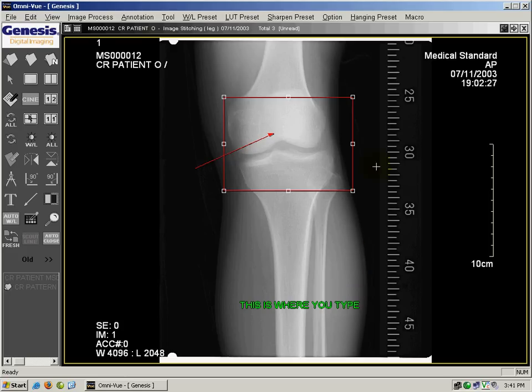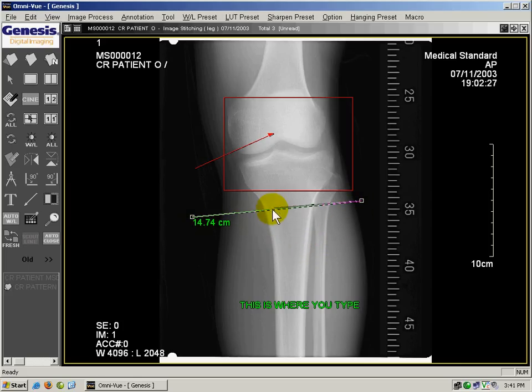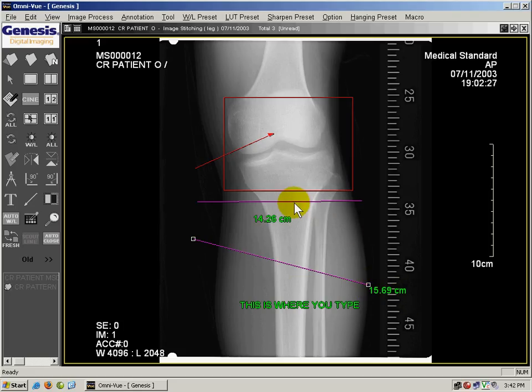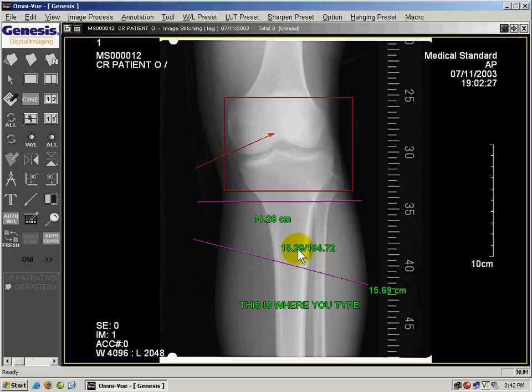You can also add measurements, which will give you the measurement between two points. Click on measure, then click on the beginning point, hold and drag it out and let go, and it will give you the reading in centimeters. You can also move the two points around and the distance measurement will automatically change. You can also get the angle between two lines by making a second measurement tool, clicking and dragging it out, holding the shift button, and clicking on the second line — it will ask to make angle information, hit yes, and there you have the angle between the two lines.